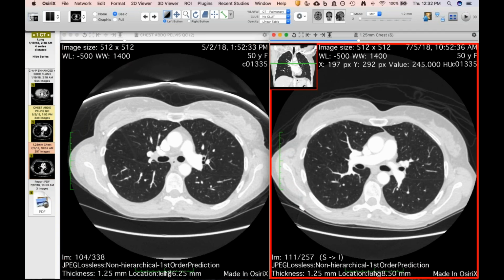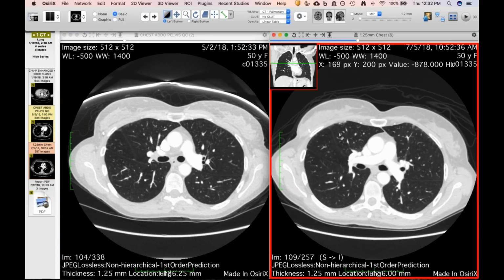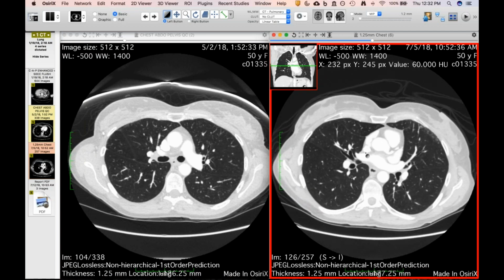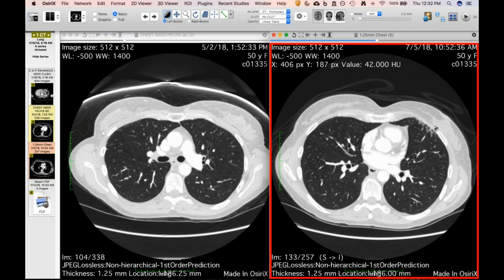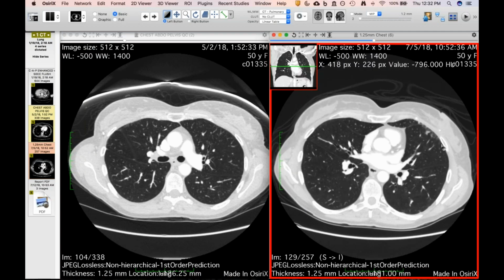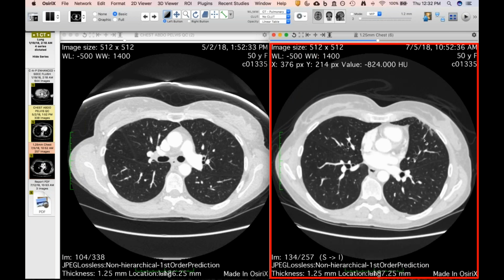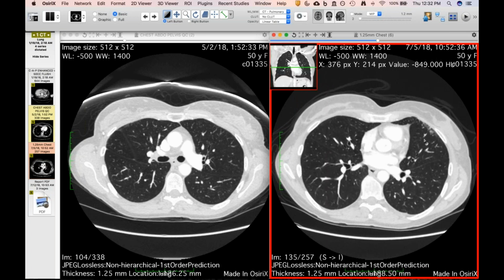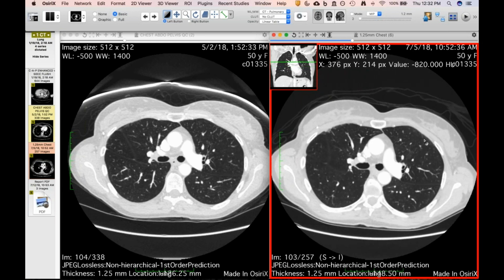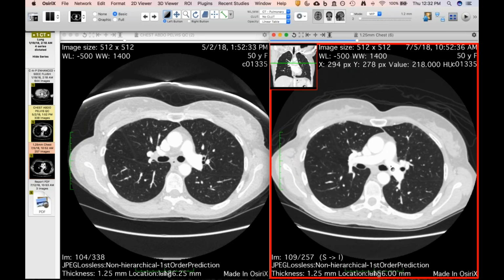So Travis, did she get any chemotherapy at the same time? This could be a recall pneumonitis from drug injury within the radiated lung field? Yeah, I guess that's the question. Would you call it a recall pneumonitis? I've seen it in people who've had mediastinal radiation years before, like Hodgkin lymphoma, I saw a case. Then the patient recurred and got some chemotherapy and developed the lung injury, but only in the treatment field.